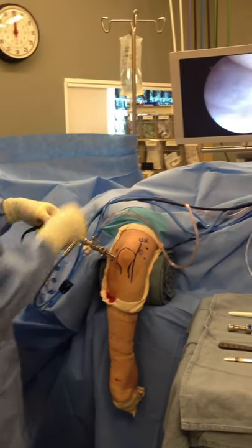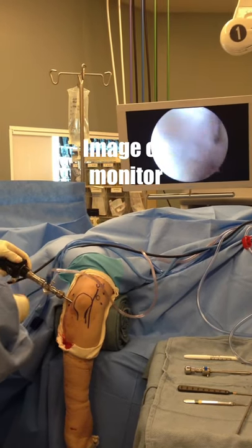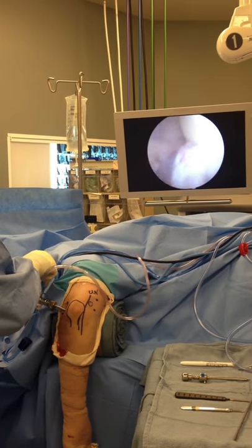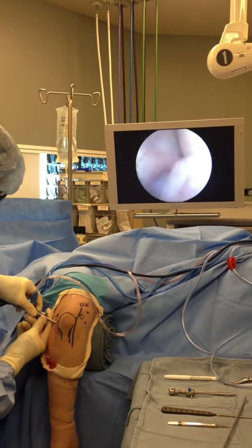Now you can see on the screen that we're inside of the joint. So now we're going to take a look. Okay, you can see the loose body that it has in there. I can see it right away. We're going to be going after that in a few minutes.